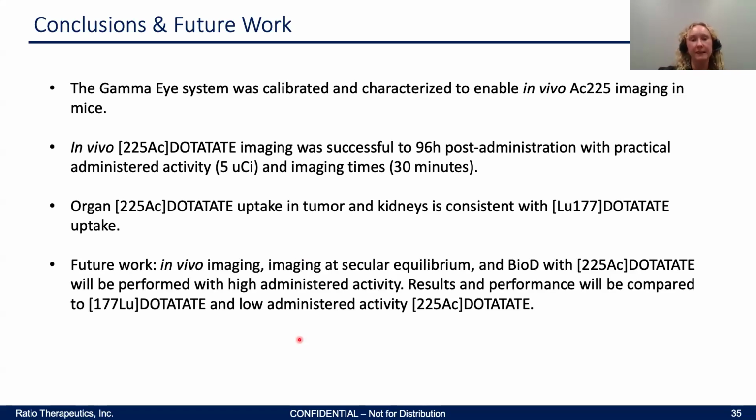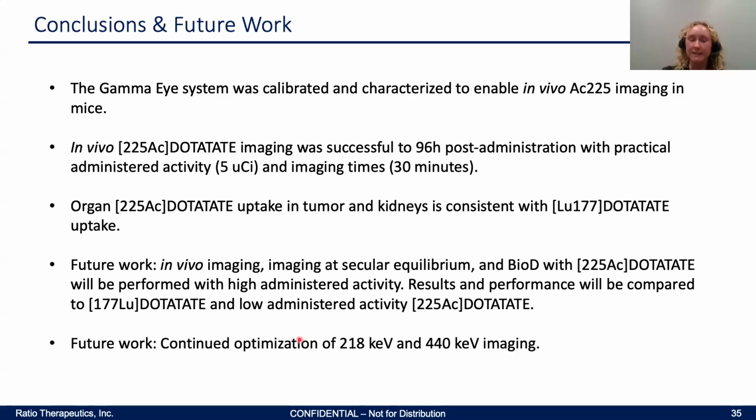Some future work is completing the second portion of that lutetium study, where we will have in vivo imaging at secular equilibrium, and then a biodistribution with actinium-labeled dotatate. And that will be performed with higher administered activity than we used in the study already completed. We'll then be able to compare the results and performance to the lutetium dotatate data, as well as to that lower administered activity actinium dotatate data. And then finally, we will continue optimization of those 218 and 440 keV imaging settings, probably a lot of continued optimization.